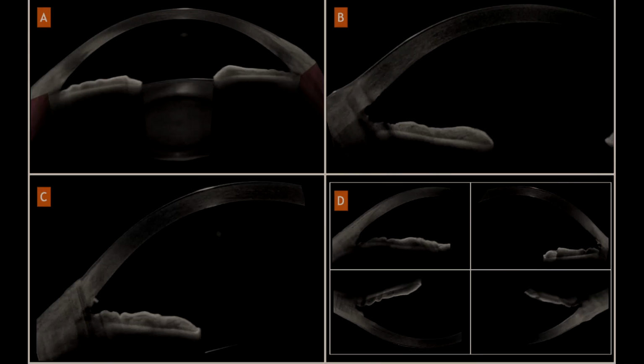To summarize the MIGS, this is the publication that is due in the Indian Journal of Ophthalmology. Figure B is the Y sign that we are publishing with KDB, and figure C, as Moideen sir rightly showed, is a remnant with the bang procedure, and you can see more of a bird beak configuration. The magnification of the suture gap is more like opening a piece of paper with a thread, right? You can see a bird beak configuration, and the orientation of the angles.